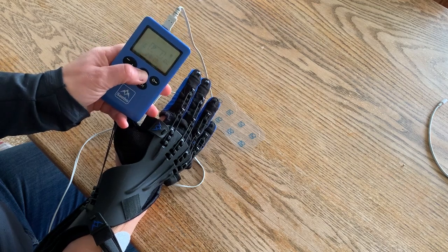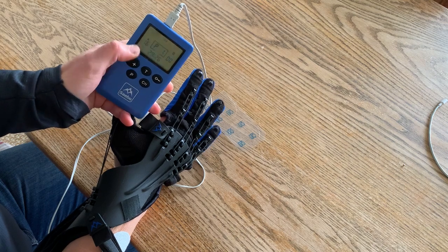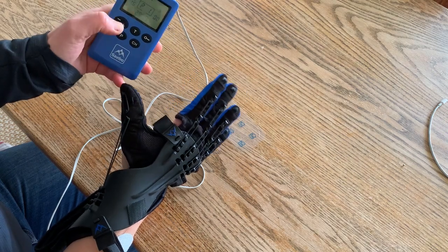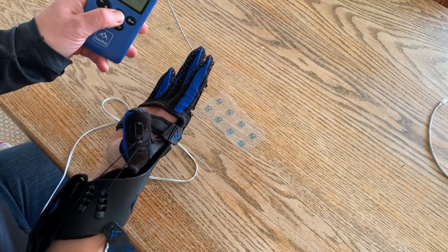To do that, make channel A flash and then press and hold the T button until a little triangle appears beneath the A. Now when I press the T button the stimulation comes on, and when I let go it stops.